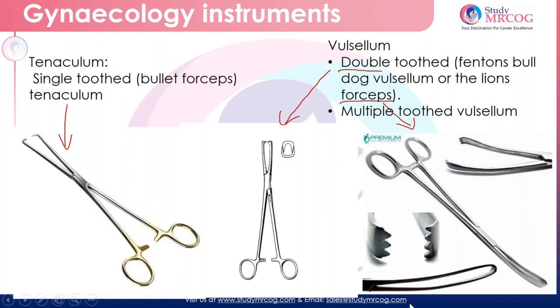I do not have these two instruments with me here. This is a tenaculum. A tenaculum is a traumatizing instrument — they are traumatic instruments. How do you describe an instrument? An instrument needs to be described regarding the handle. It has got a ring handle with a ratchet and the shaft. It has got a box. Both the jaws end in a sharp right angle at the tip. This has a single tooth — the tip of the jaw ends with a tooth, and they approximate on each other at the tip. They do not interdigitate; they approximate at the tip, thereby giving a clear hold on the cervix. This instrument is used to hold the cervix.